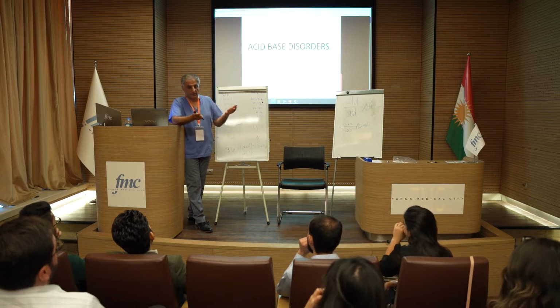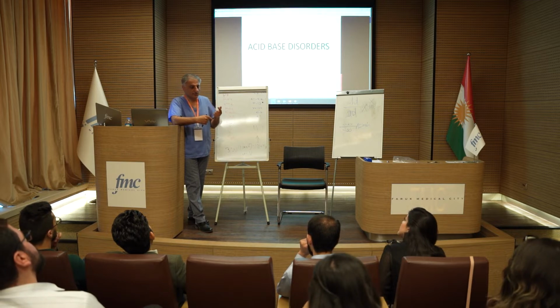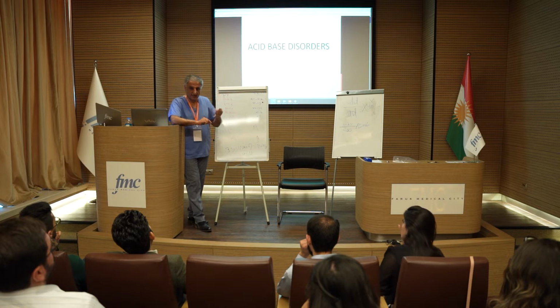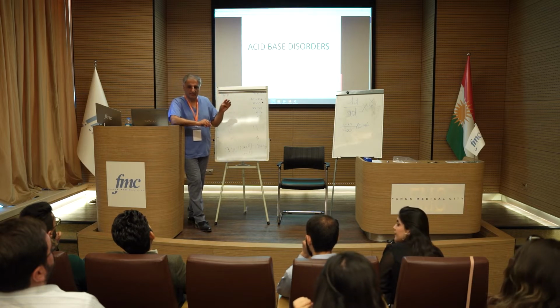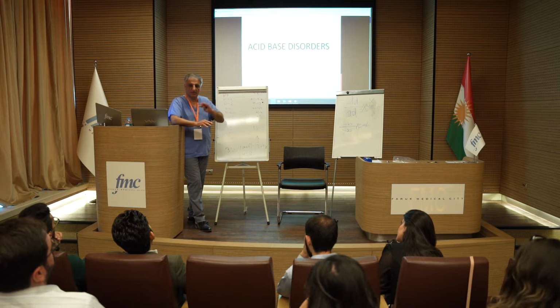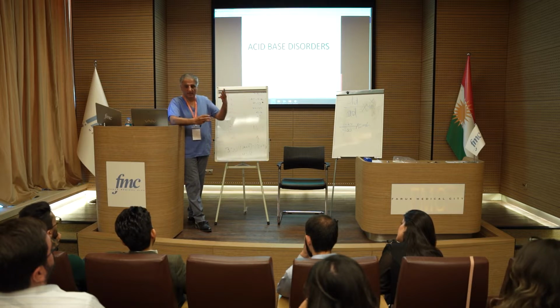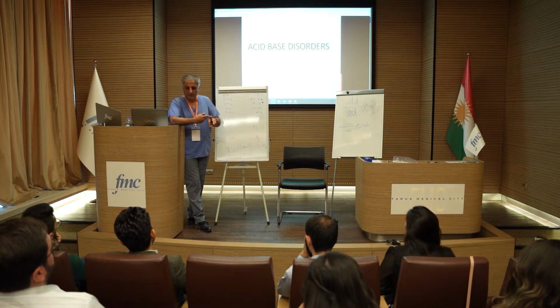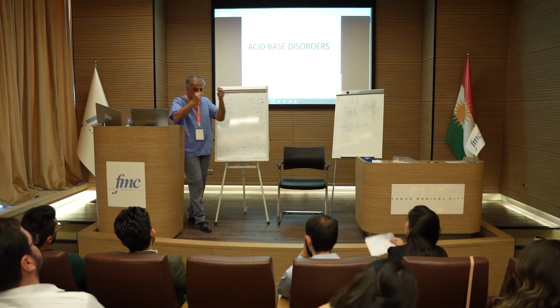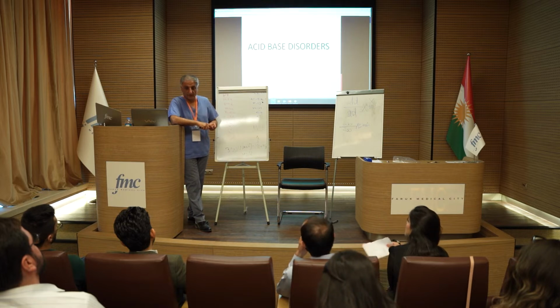You can remember it like this, but I think it's confusing. If you really want to master your blood gas, you have to understand what the acid is, where the acid is coming from. Is it from the metabolic element or the respiratory element? There are only three variables here: the pH, the respiratory element, and the metabolic element. As long as you analyze it in your head, it shouldn't be a big deal.